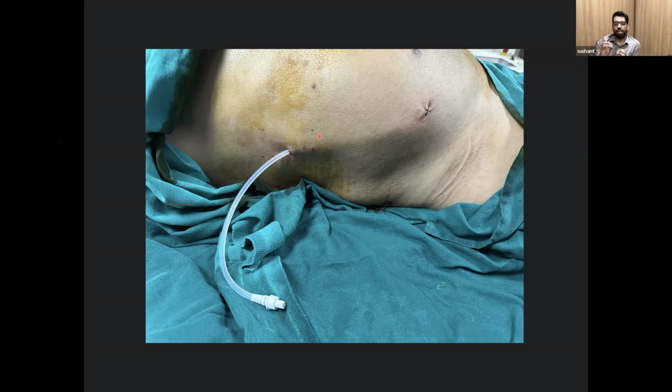And if we just need to drain a clear fluid, if it is tubercular, a normal ascitic fluid, or a pleural fluid which is exudative in nature, and there is no septation, no blood, we can use smaller catheters like 8 French or 10 French. And if we want to do the similar thing in a pediatric population, we have as small as 5 French, 6 French, 7 French. These catheters can be used from day one of birth, according to the indications.